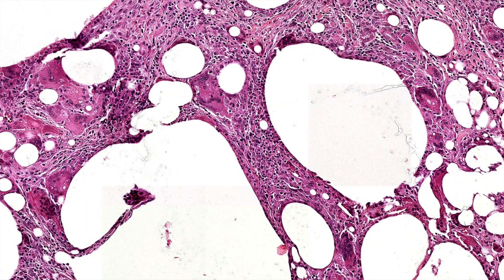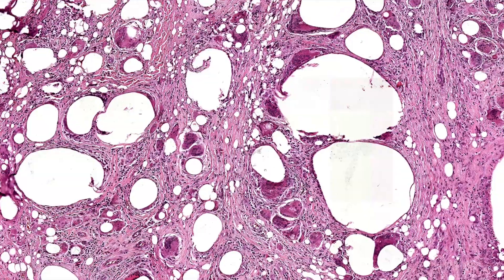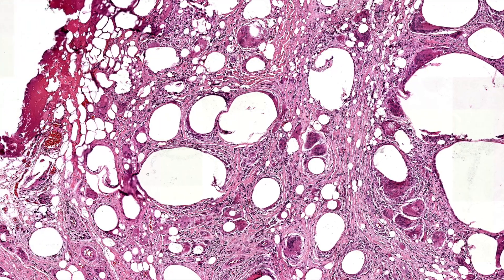The few times I saw this when I was in training, that's what it made me think of. Anytime I see this pattern of big cystic clear spaces in a foreign body granuloma, I go looking for clear stuff and also polarized light.